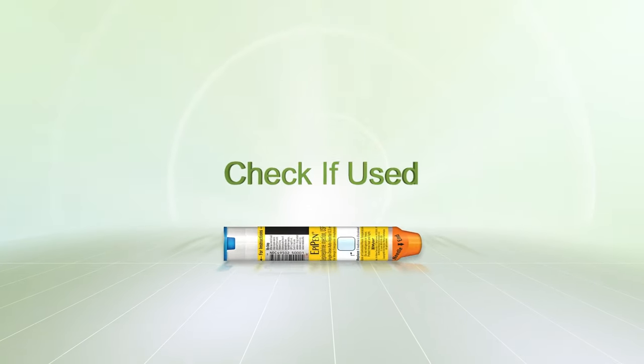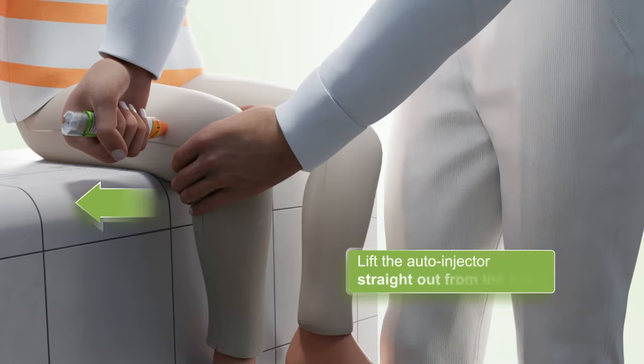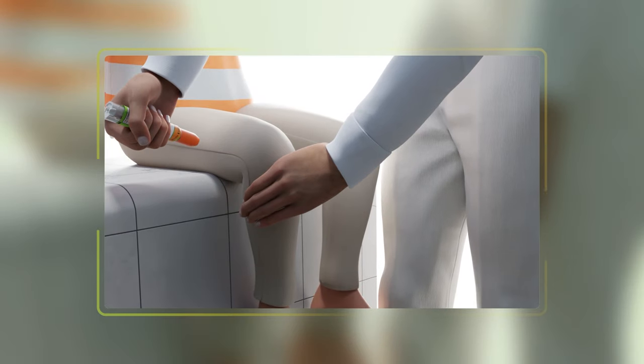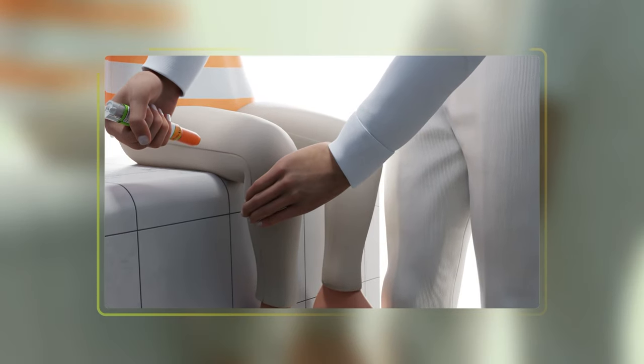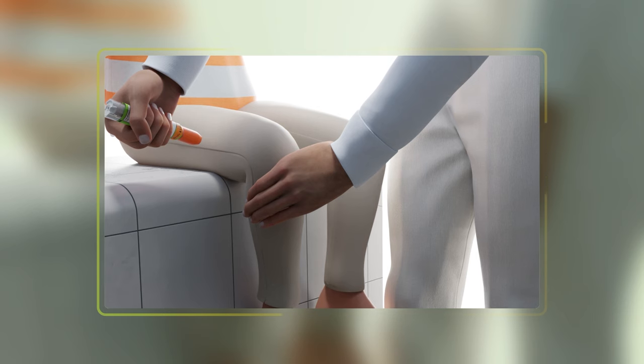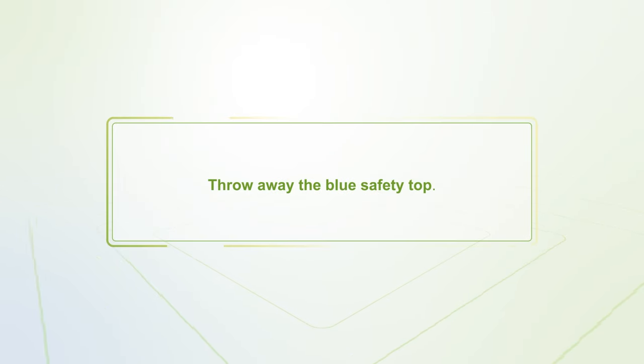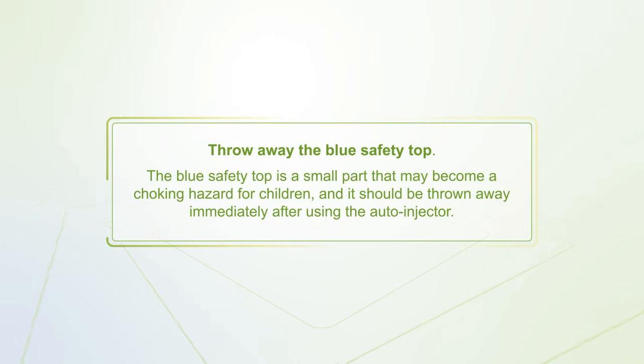Check if used. Lift the auto-injector straight out from the thigh. The orange needle end will extend to cover the needle. If the needle is visible, do not reuse it — use a new auto-injector. Throw away the blue safety top, as it is a small part that may become a choking hazard for children and should be thrown away immediately after use.